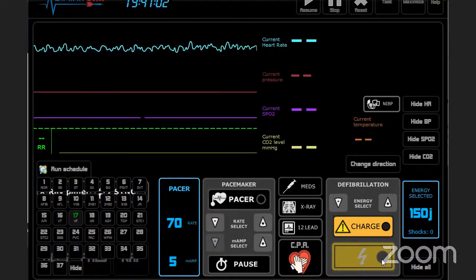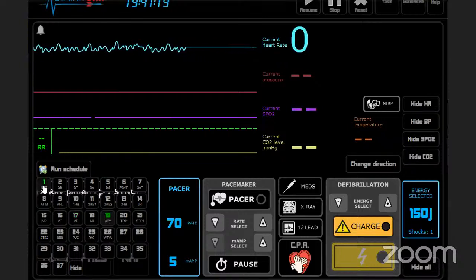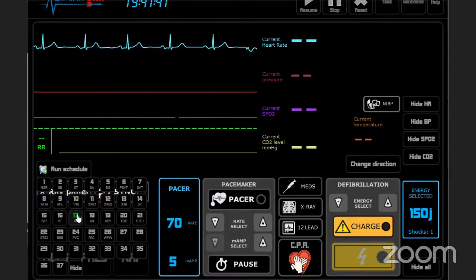Again, remember yesterday we said, once you shock the patient, the next thing you want to do is to resume chest compression. So I'm going to charge the machine here and watch as the light fully comes on. Okay, so I need to press the flashing button now. Again, when I press the flashing button, I need to look out and make sure if there is a return of spontaneous circulation. I'm going to check the pulse and see if I've really defibrillated this patient. So that's how you want to carry out defibrillation.